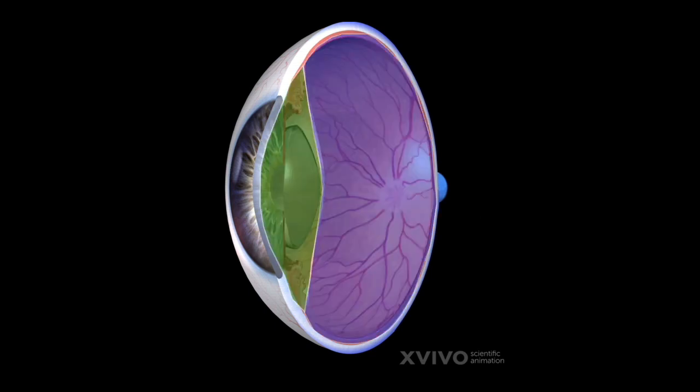And so, again, consciously look at the anterior chamber and the posterior chamber. Most of what you're going to see is in the posterior chamber, but really consciously look at the anterior chamber so you don't miss something, like a lens dislocation or a foreign body that's unexpected.